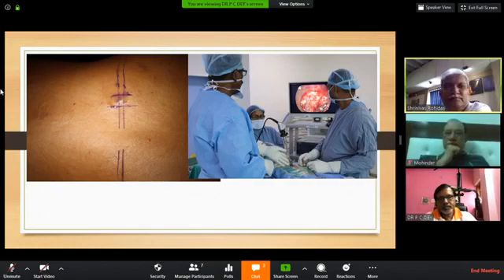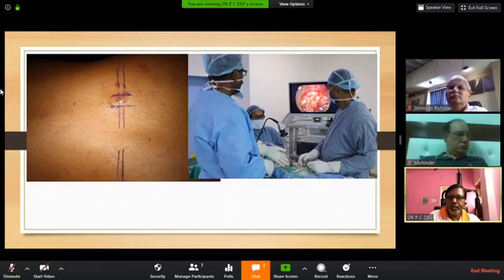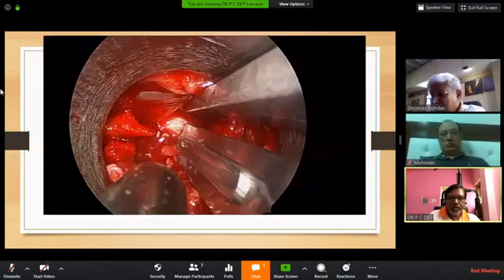Good. So this is the thing I just wanted to tell the viewers: if there is any problem or any doubt, don't hesitate to check again. It takes hardly 1.5 or 2 minutes to check again. So be familiar. You talk to your assistants and the X-ray technicians. They should be well versed in how to do that.